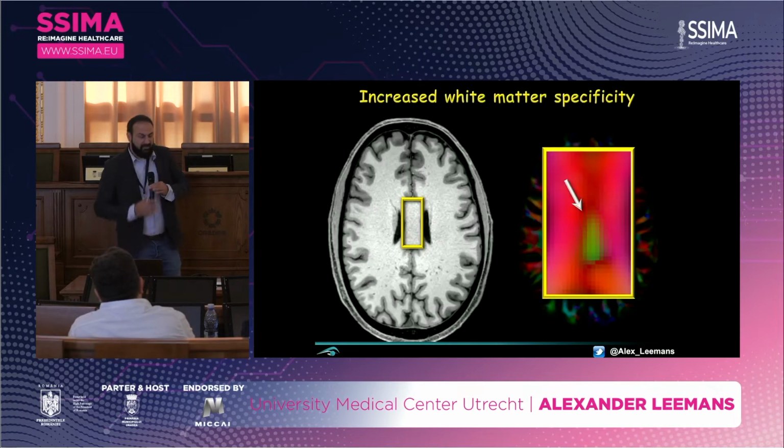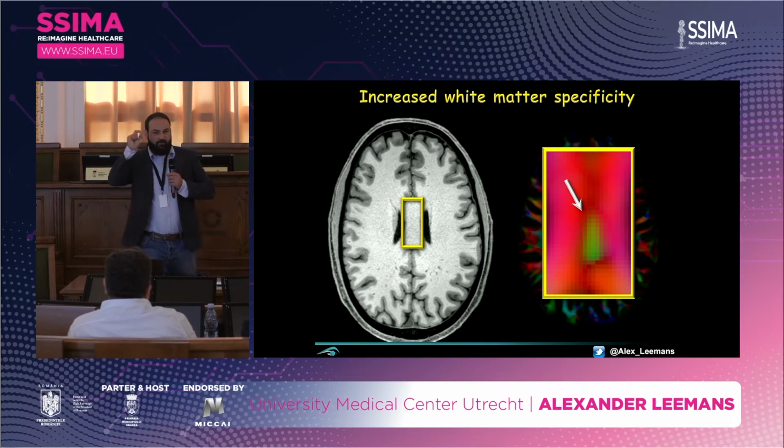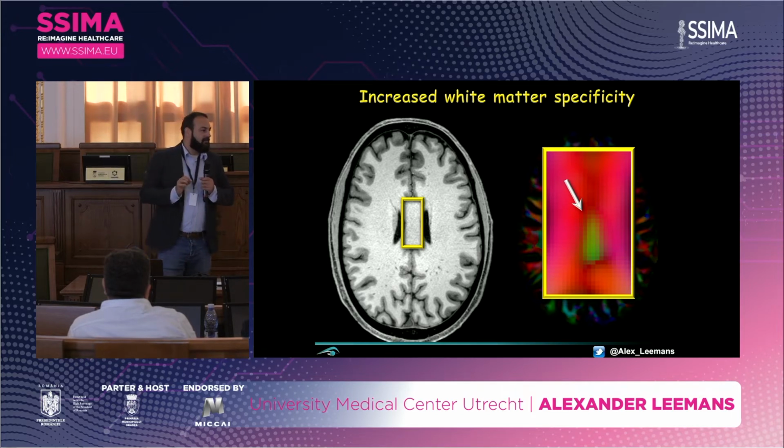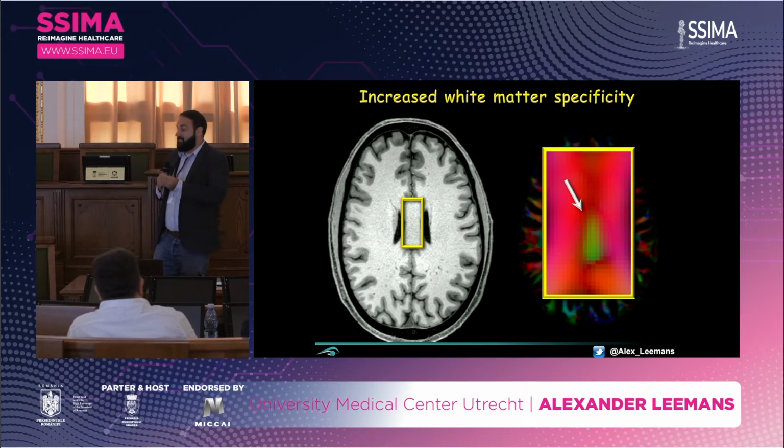And what that green patch basically represents is a hyperplasticity. So in this case, the subject had pathways going front, back in the middle of the corpus callosum. Okay? What does it mean? We don't know. But what it does say is that our brain is more versatile, more complex than we thought it was.